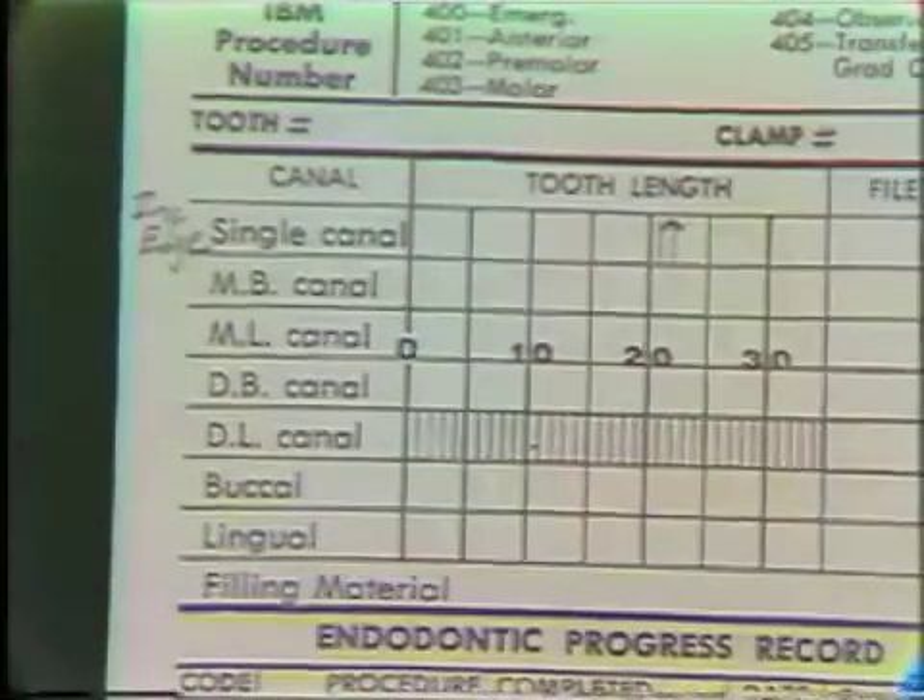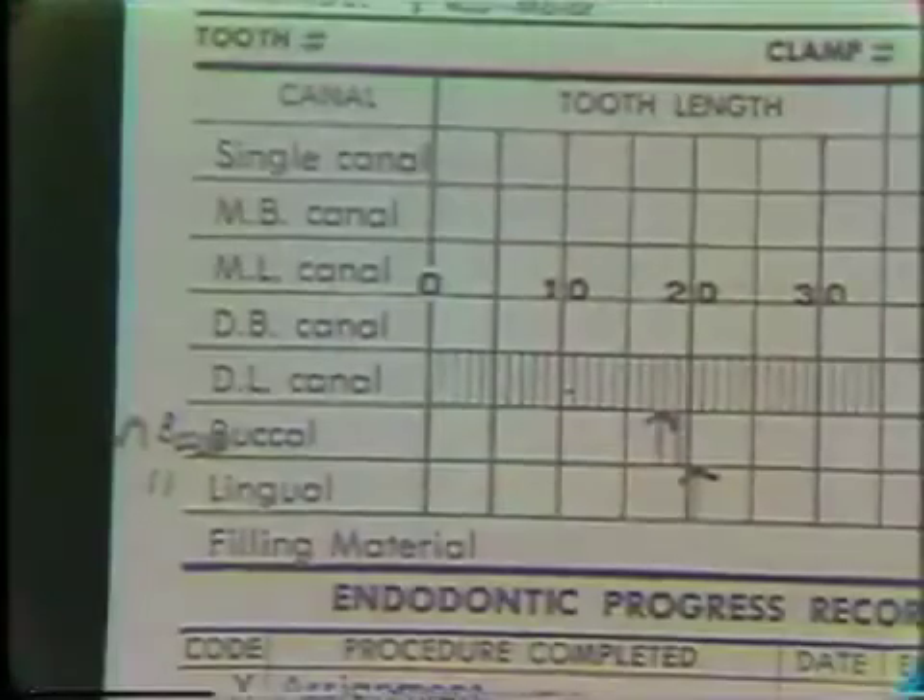And here is a radiograph of a molar with files inserted into the buccal and lingual canals. This goes along with packet number three. The marks on the packet indicate the length to which the files were inserted into the tooth. Mark the adjusted, accurate length. Your chart should look like this.